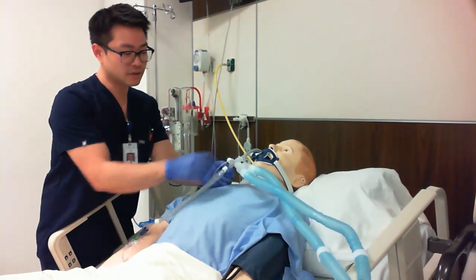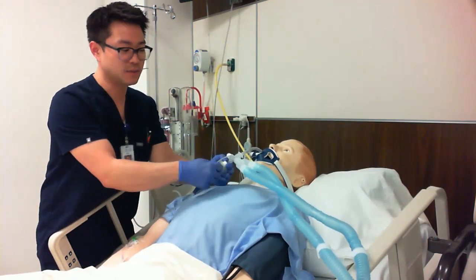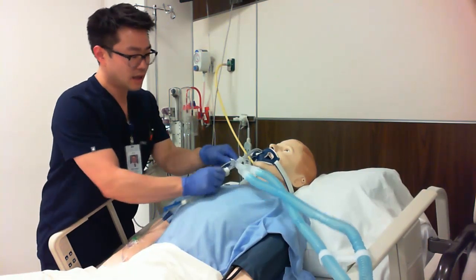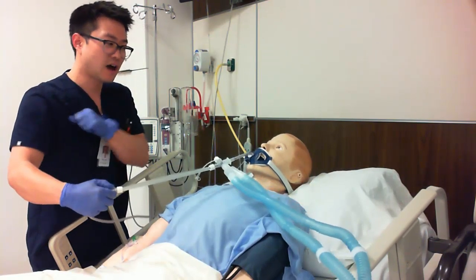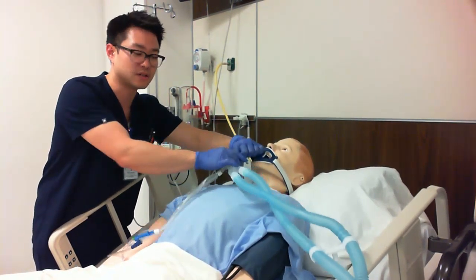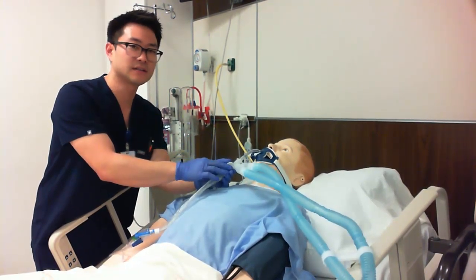Also, one thing to be mindful of: while I am pulling the catheter out, I'm holding on to this T-piece very tightly and pulling it out. We do not let go and just pull on the end of this suction catheter. If I just do this, I am pulling on the tube. It is unstable. I could actually remove this tube from the patient. So make sure you keep your hand on here at all times, all right? Great.